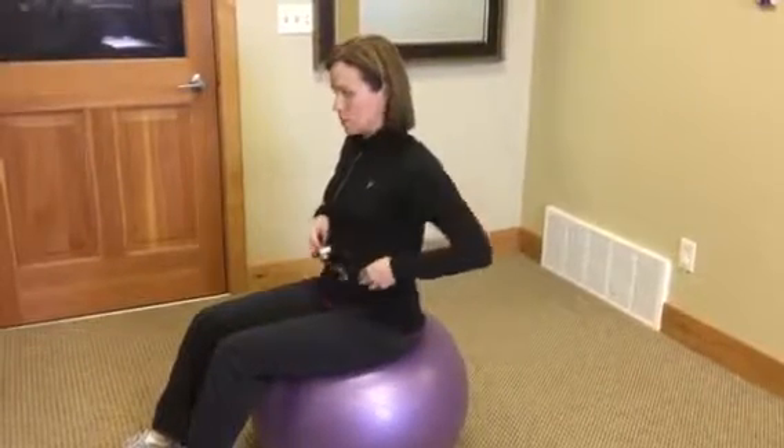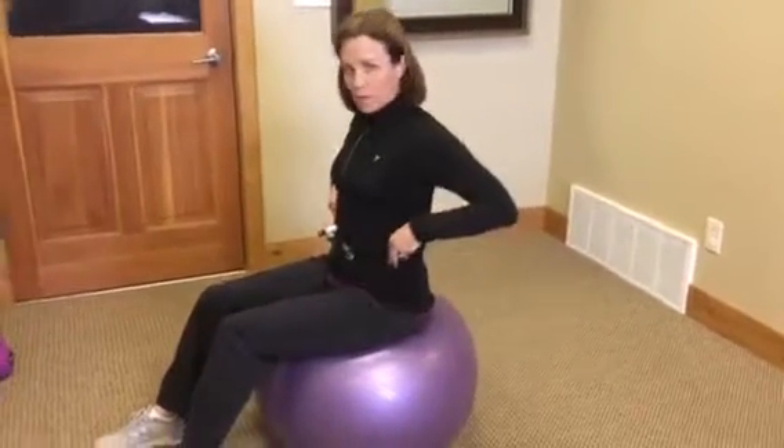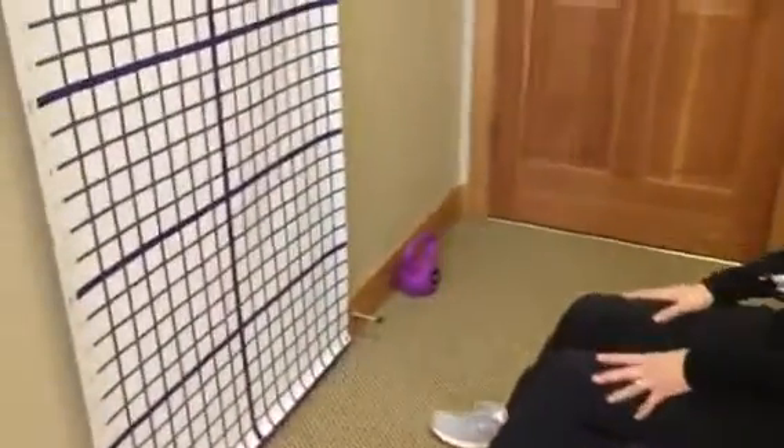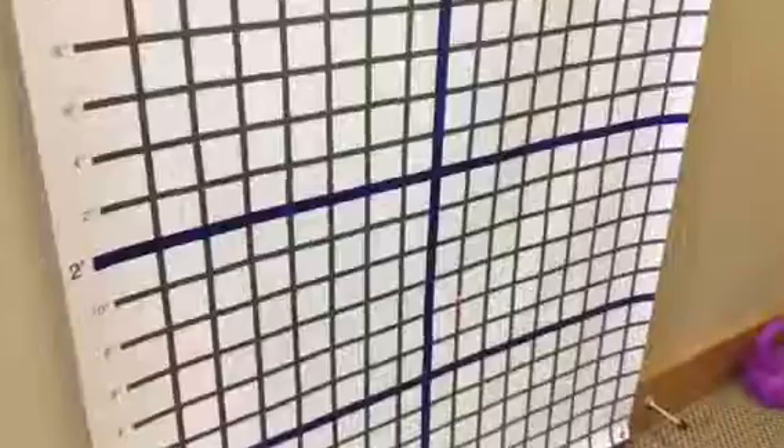Hi, it's Jill with ProPhysio and today I'm here to talk about the motion guidance laser for lumbar stabilization. What we're doing here is we're placing the laser around the waist and then utilizing our therapy grid to give the patient their own feedback as to how well they're doing with their motor control.